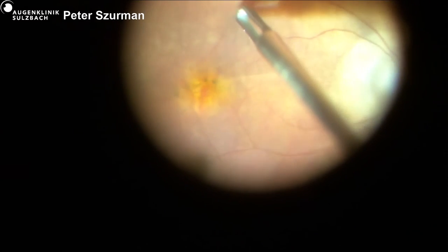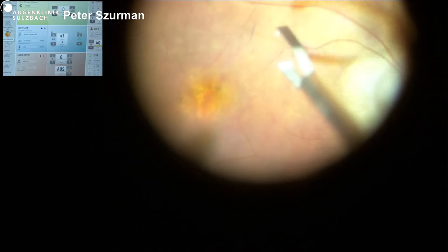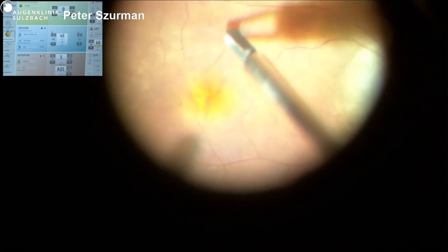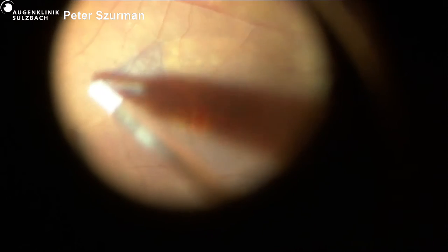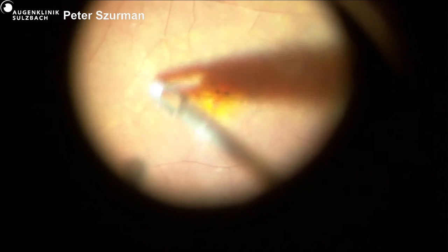So, Peter, we're back with you. We see you are peeling away. Yes. So we don't have a real traction. So this peeling is just a standard peeling of the ILM. There is no epiretinal membrane at all. And you see that we have a certain atrophic aspect. And I hope you see the preoperative OCT.